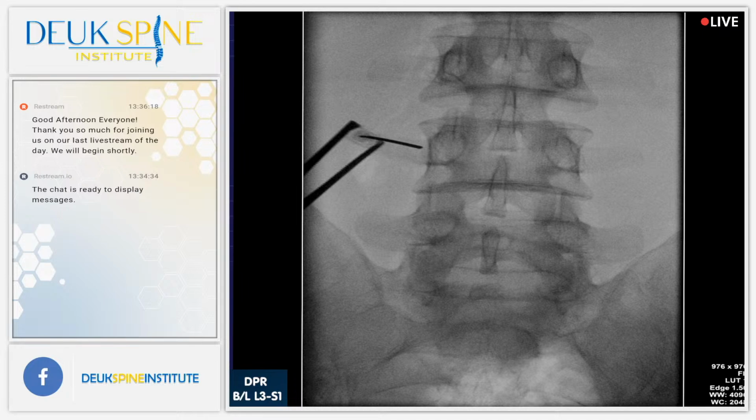Can you see what I'm doing? You need to be watching so you can know what I need. That makes sense? Otherwise it just adds more time.